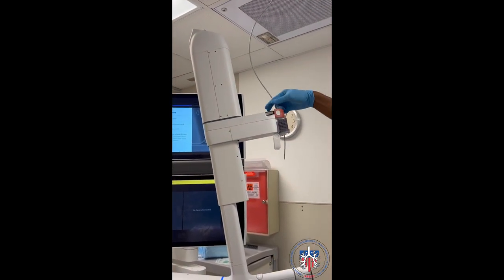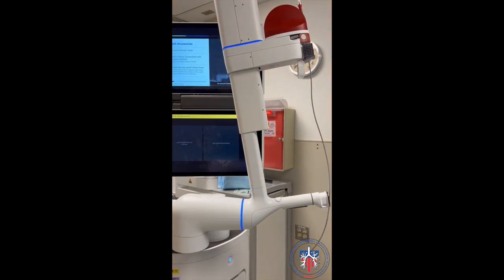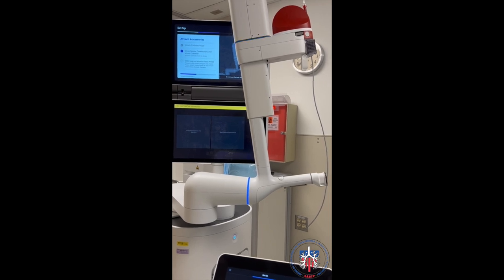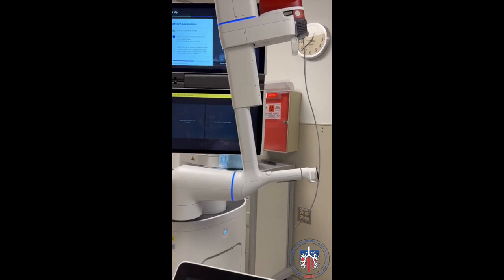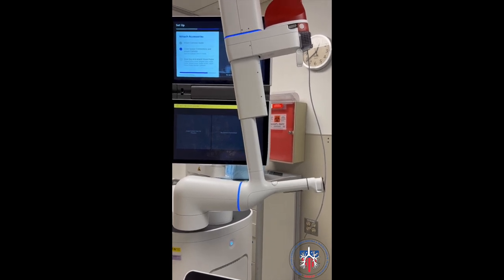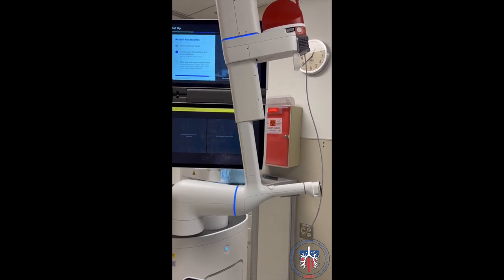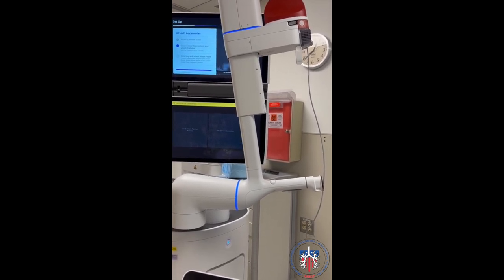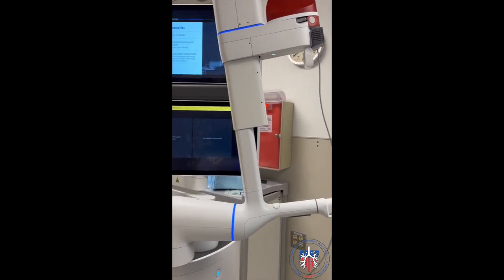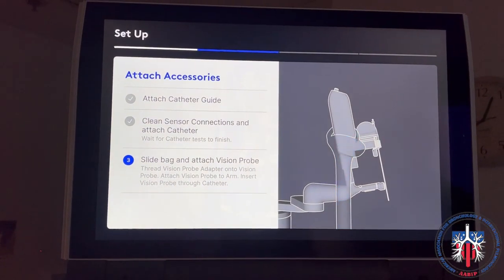After cleaning the sensor connections, thread the catheter and install the unit on the robotic arm. The catheter performs self-tests with rotational movements, as shown here. The vision probe is assembled as the next step.